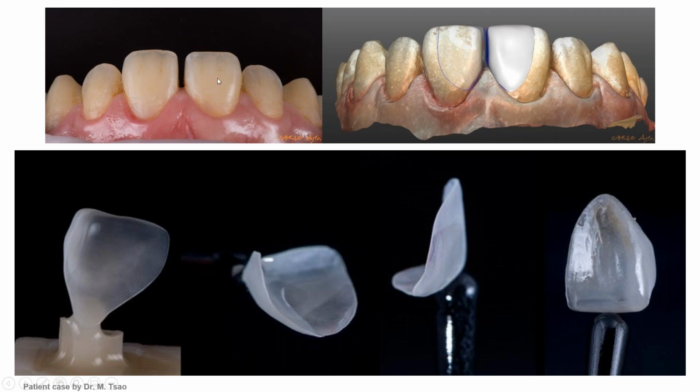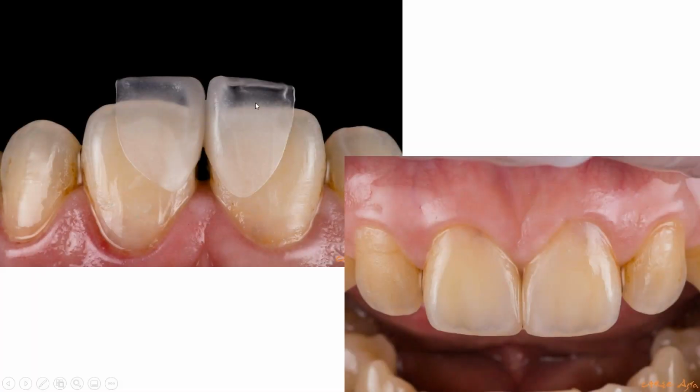So you need to select a material and prep for a material that might be more transparent, a little bit more like a lens effect. This is a material called Enamic. It's super translucent, down to about 0.2 of a millimeter and then polished. And you can see it's pretty much see-through. And then we may add some light-cured stains to it. But once they're placed, they're so transparent that if the margin and finish line are done correctly, you can't even tell that these have been modified cosmetically to fill in that gap. It becomes part of the tooth.